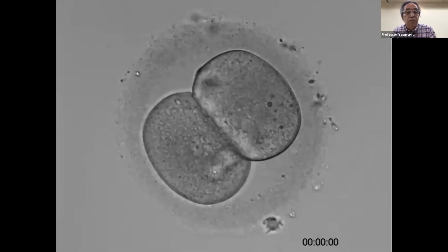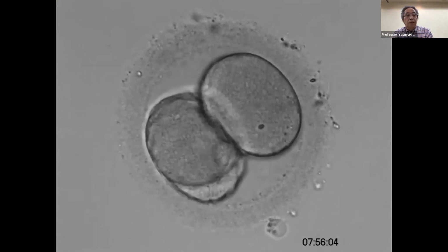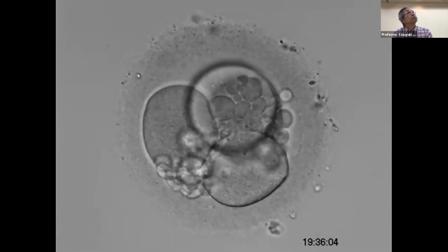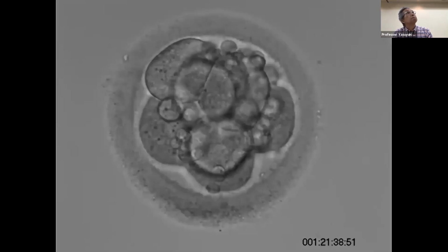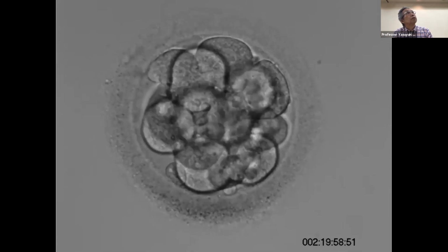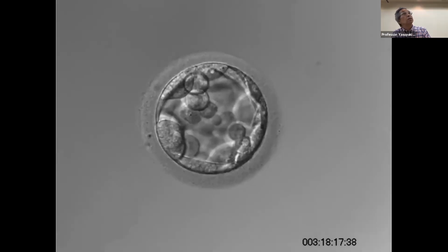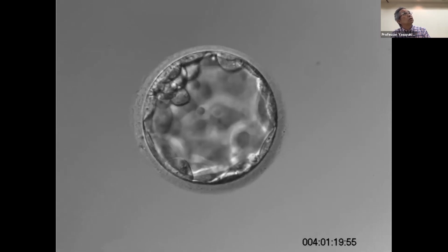This is another first movie, from the two-cell stage to hatched blastocyst. The mitotic divisions were repeated, then reached morula. Now going to morula. And the embryo developed to blastocyst, and then the blastocyst cavity expanded. You can see the inner cell mass located at 10 o'clock.